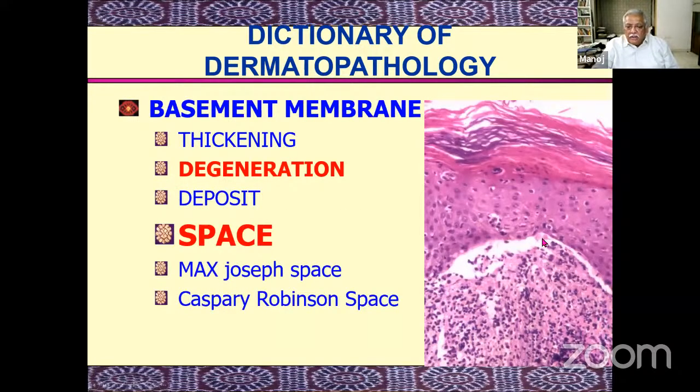And this particular space actually is also of great interest. This is a fairly diagnostic lesion. This is from a condition called lichen planus, which most of you would have heard of. So when you have a degeneration of the basement membrane because of this inflammation, you have this space forming above this inflammation. Space is called the Max-Joseph space. And the reason it's called the Max-Joseph space is, of course, because neither Max nor Joseph were the first to describe it. It appears that two gentlemen called Caspary and Robinson had already described it, but it became known as the Max-Joseph space. But important thing being that this is a result of basement membrane not being fully formed.